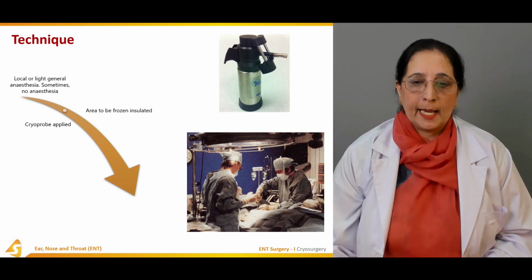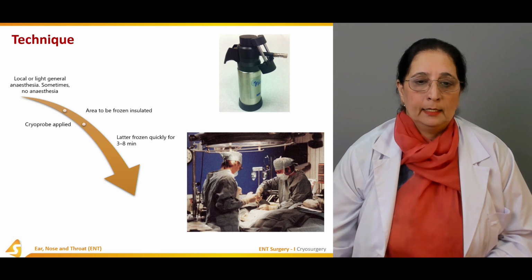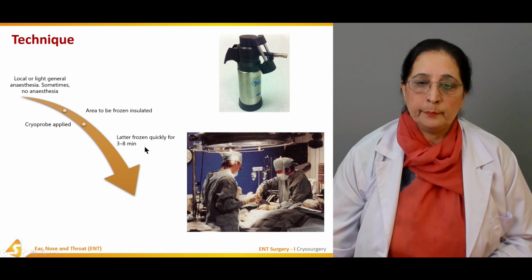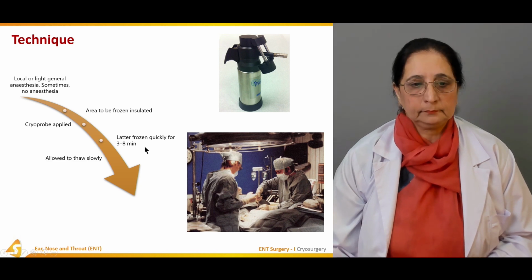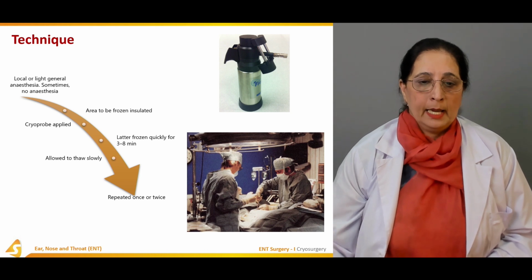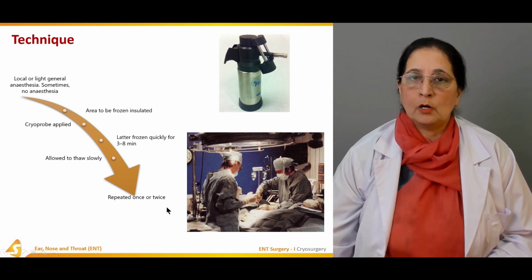The cryoprobe is applied. The area is frozen quickly for 3 to 8 minutes, allowed to thaw slowly, and the cycle is repeated once or twice.